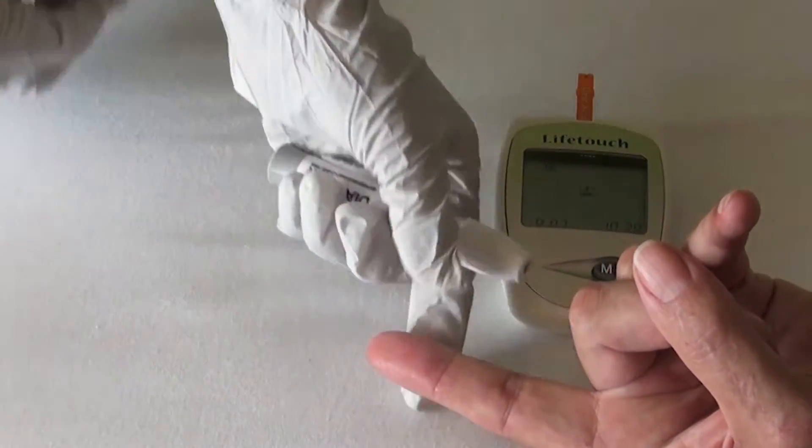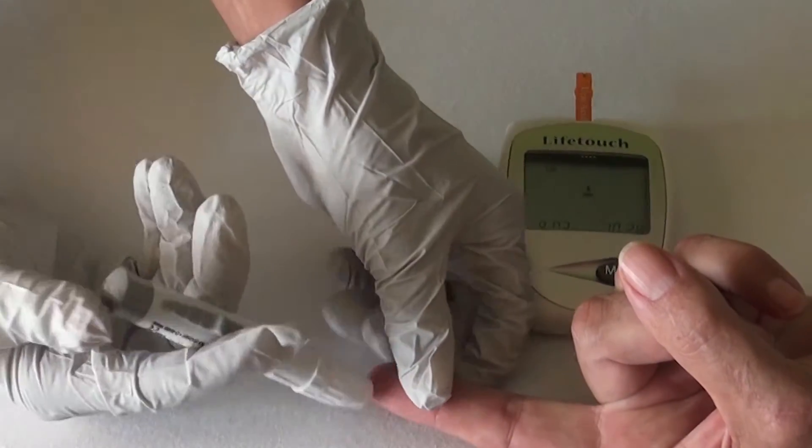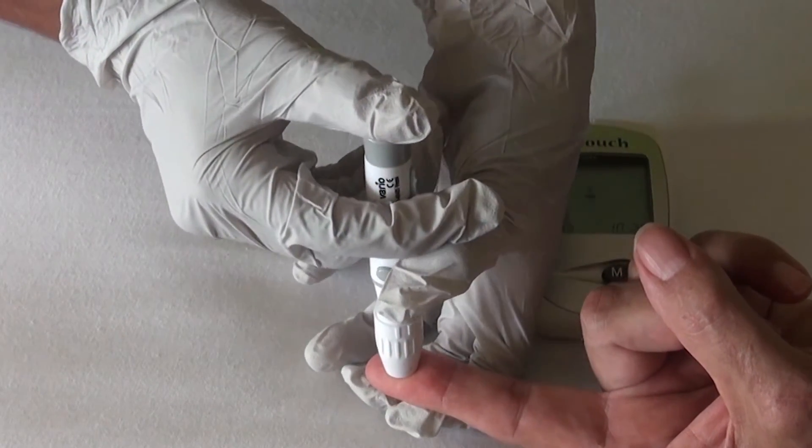Disinfect the sample area and wait a bit. Puncture the finger with the lancet and wait until a nice blood drop comes out. If the drop is very small, try again to get a larger one.